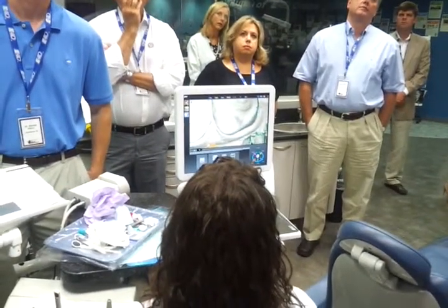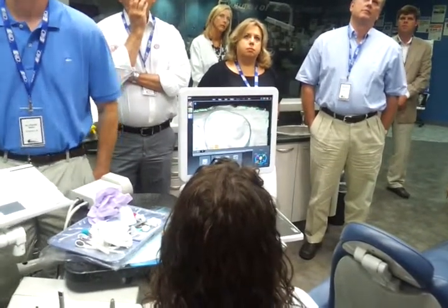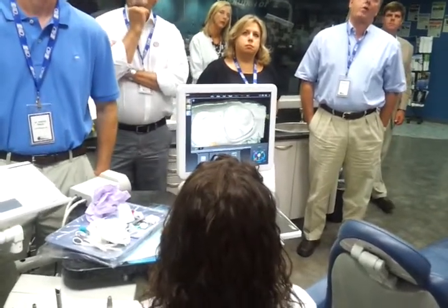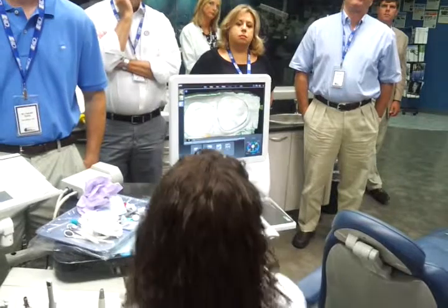So once I have my margin pulled all the way up to the edge, I kind of like to move in a counterclockwise rotation so that I know exactly where I'm going. There we are. Very nice. Now, so I've got this margin drawn, I'm ready to move over to tooth number 19. Once tooth number 19 is drawn, I'm going to move on to design.